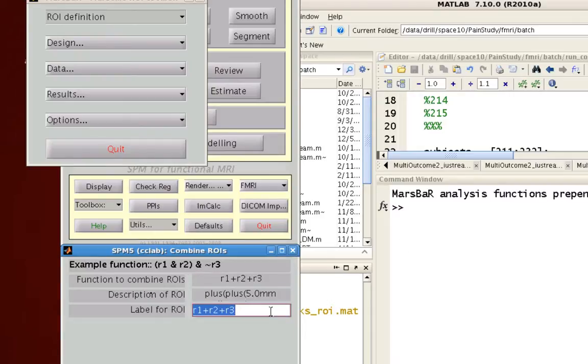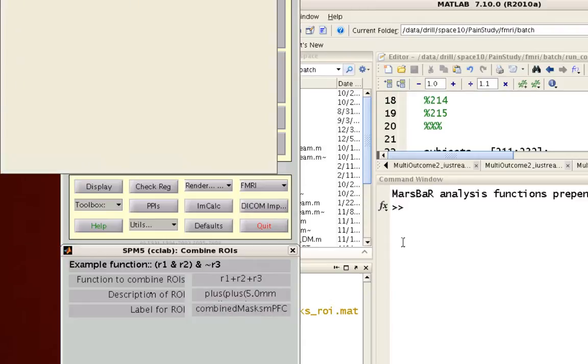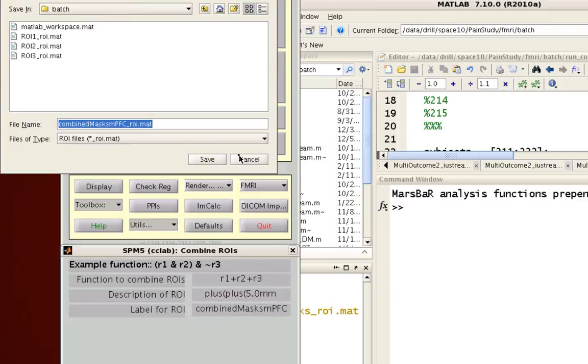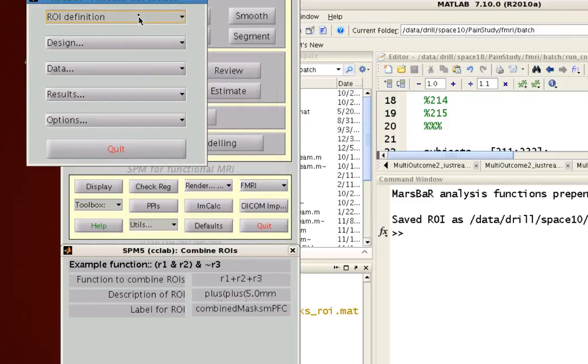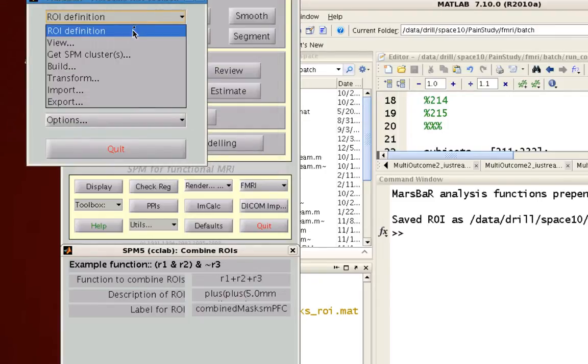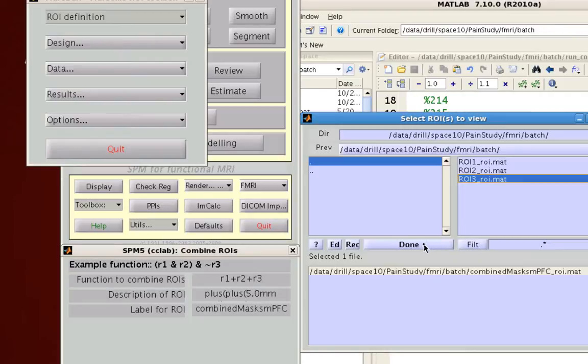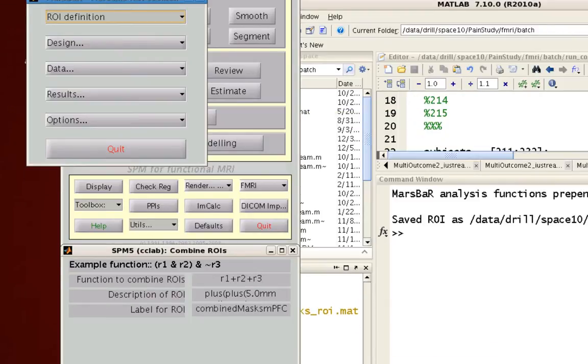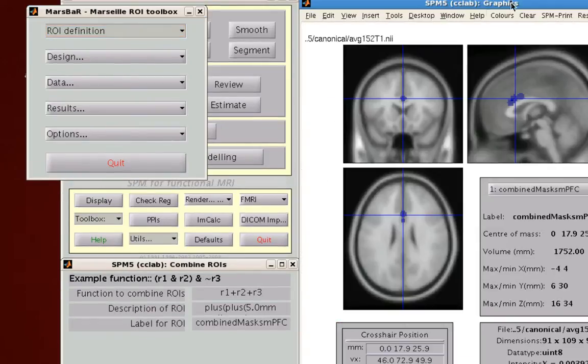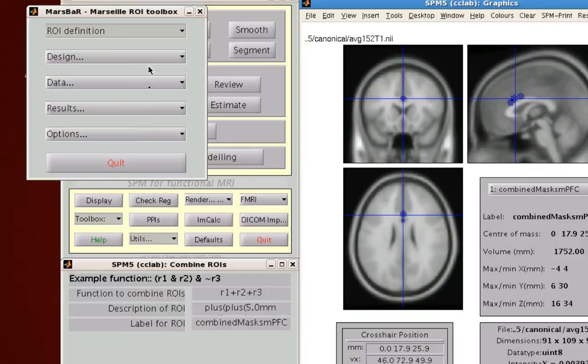Description is fine, and I'm going to call this combine masks mpfc. So once that's done, save out that mat file, and then to actually use it, first we're going to view it to make sure it's okay, and it looks like I can combine them all satisfactorily.